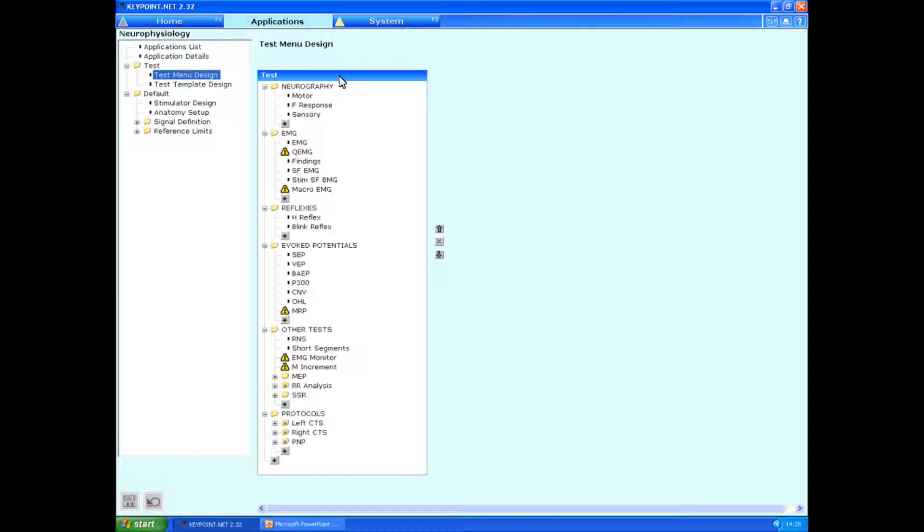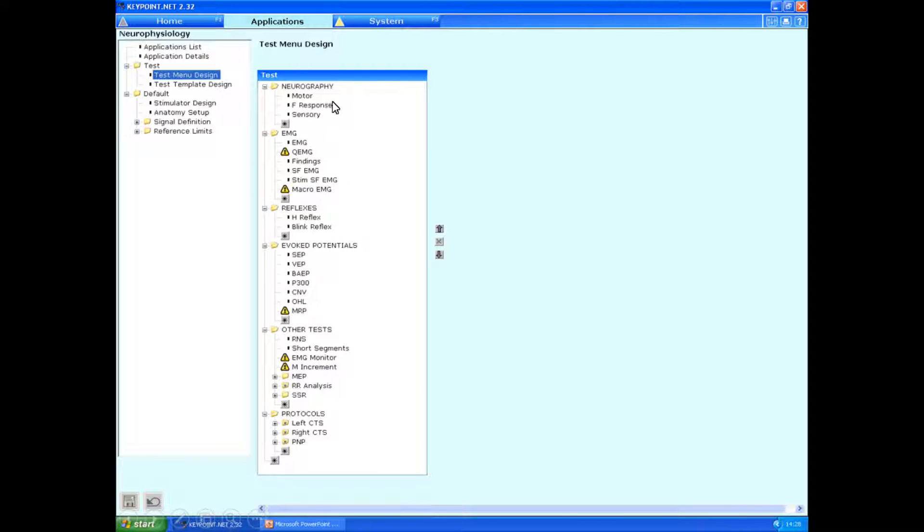After you've done this, it automatically goes on to test menu design. And here we have the standard sidebar: neurography, EMG, reflexes, evoked potential, other tests, and then protocols.